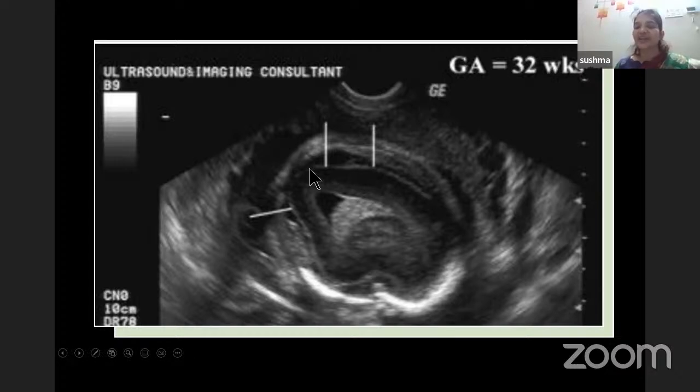So this one is a difficult one. That's why I would like to answer this. Listen carefully, the brain surface is bland without any sulcations and gyrations. As we all know, an adult brain has multiple sulcations and gyrations. But how about the fetal brain? When do we get sulcations and gyrations? For that, I'm going to show you this next image.